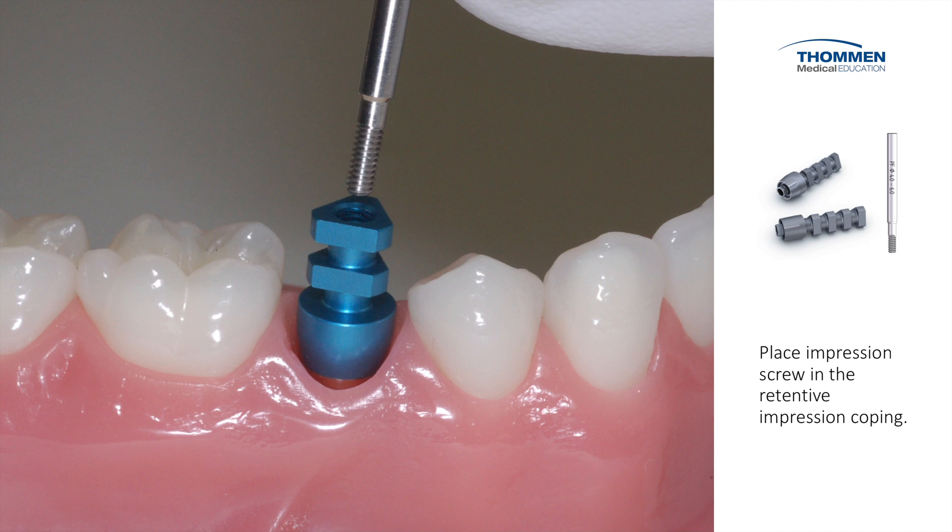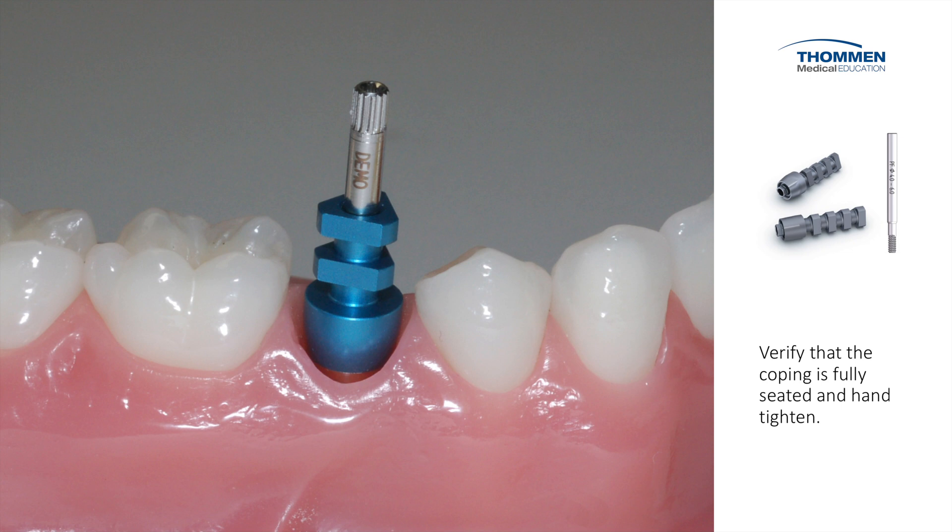We place the impression screw into the Retentive Impression Coping. We verify that the coping is fully seated. We then hand tighten.